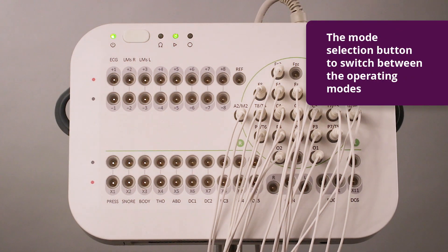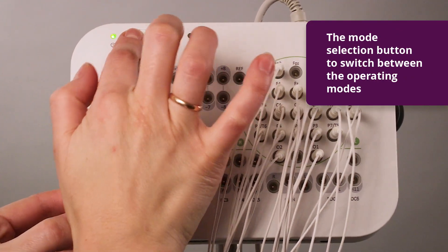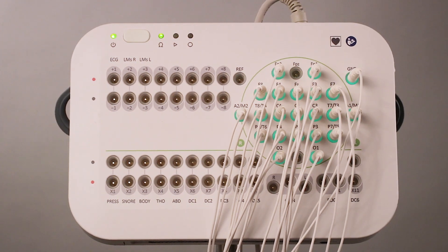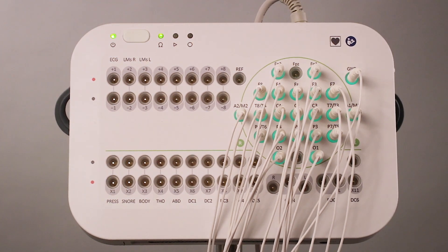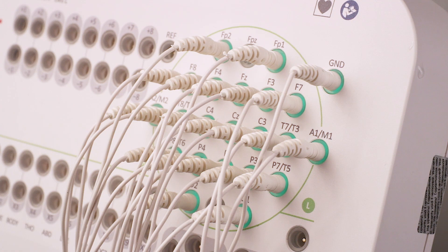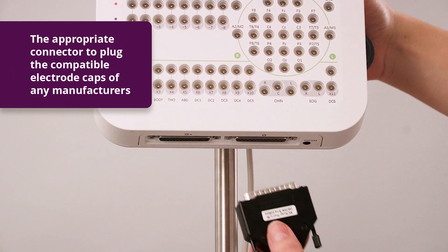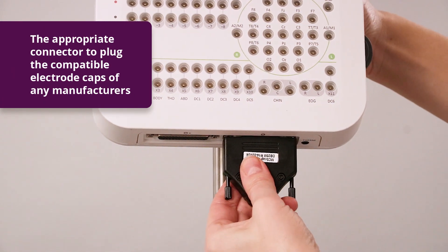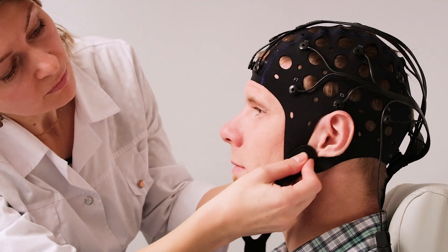You can also change the mode using just one button on the front panel of the device. A special indicator will show if the device is in acquisition mode or impedance measurement mode. The appropriate connector is used to plug the compatible electrode caps of the manufacturer.